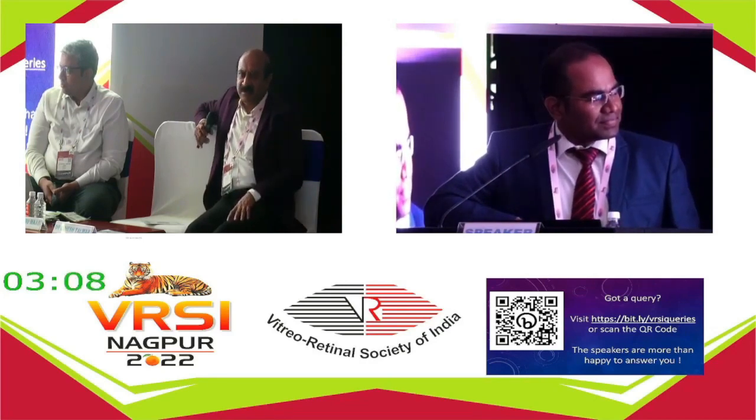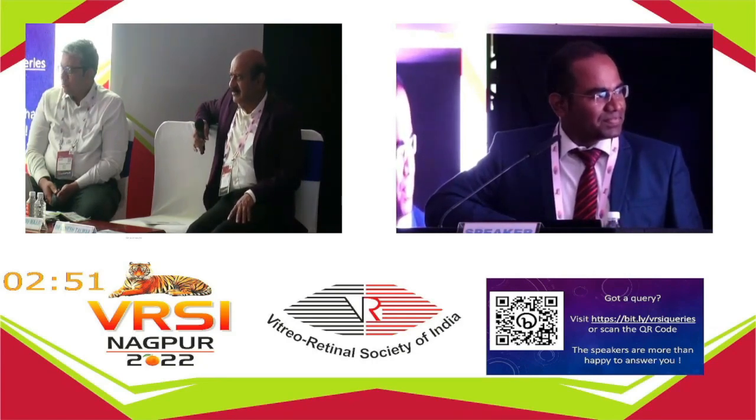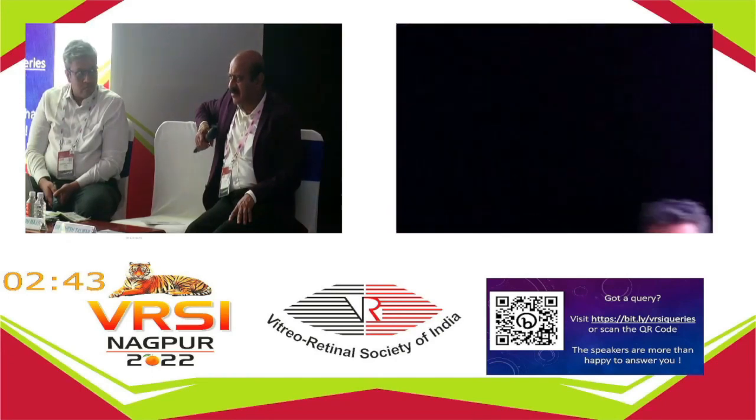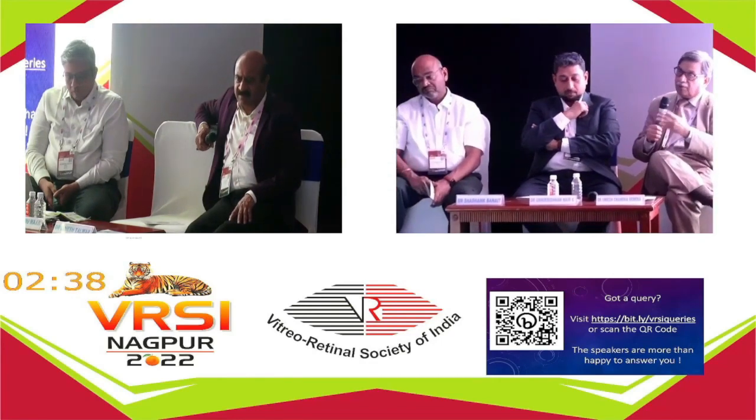If you have a patient who's got a CNVM, who's been getting treated, and now you've got a certain level of changes on the OCTA, and you want to know, is there a new recurrence? I think one of the quickest ways to pick it up is on an OCTA. The fluorescein and the ICG will not be as effective as an OCTA in that situation. So there are enough indications.